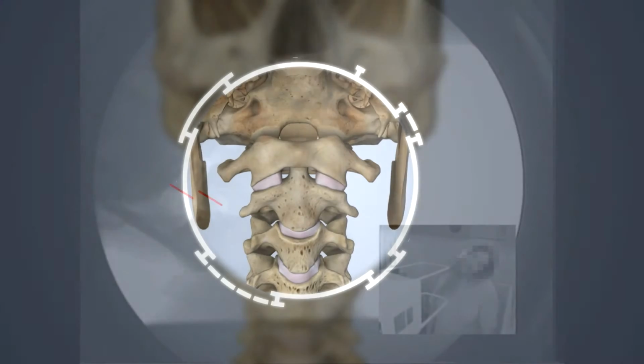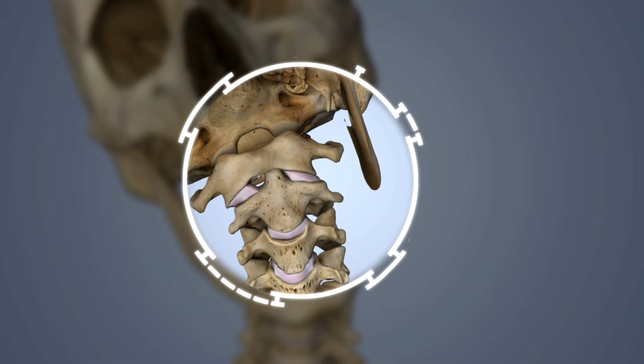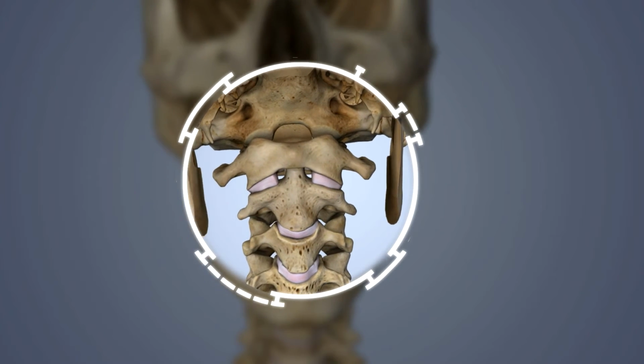So now when the person tilts to the side, we have to get them lined up so the teeth are out of the way, and we draw a line at the edge of this vertebra, and at the edge of this one, there's a big gap. Well, that means that that ligament has been torn, and it's allowing that vertebra to slip off to the side. So now you see that they're not lined up like they should be. And this causes specific symptoms, typically neck pain at the back of your head and severe headaches.